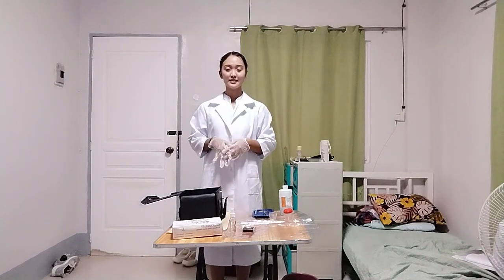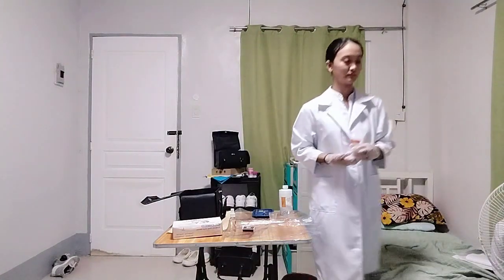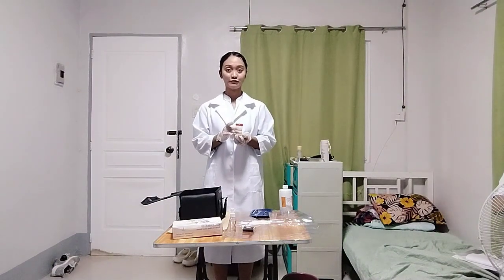Then next, hand the sterile specimen bottle to the client, then ask the client to have a midstream catch of the urine specimen. So, I'm going to obtain the urine specimen from the client. So, I already obtained the urine specimen of the client.